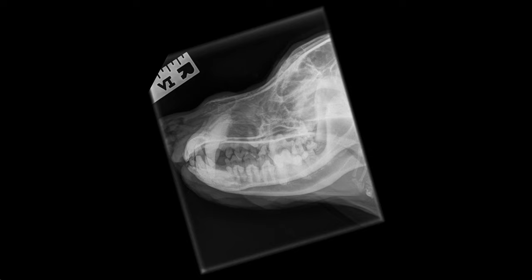In this series, we have a VD, a lateral, and an open jaw VD view. In the latter, they place the detector in the mouth to the commissures and focus on either the nasal cavity or the mandible. In this case, the focus is the nasal cavity. This view reduces the superimposition of other bones, including specifically the mandible.